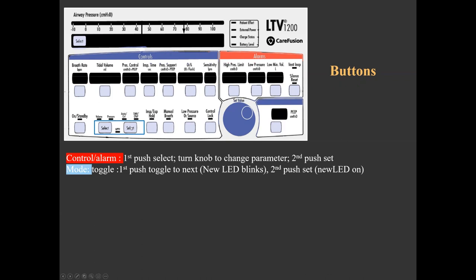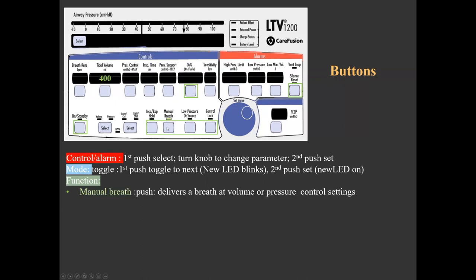The mode button allows selecting the breath type or ventilator mode. For example, to change the vent mode, when its control button is pushed, a flashing indicator appears at the next available mode; if pushed again, the new mode is selected and the indicator constantly illuminates. Pushing the manual breath function button delivers an extra breath at the preset volume or pressure. Pushing and holding the O2 flush button increases oxygen delivered to 100% for a predetermined, adjustable period. Note that this button serves as both a control and a function button.